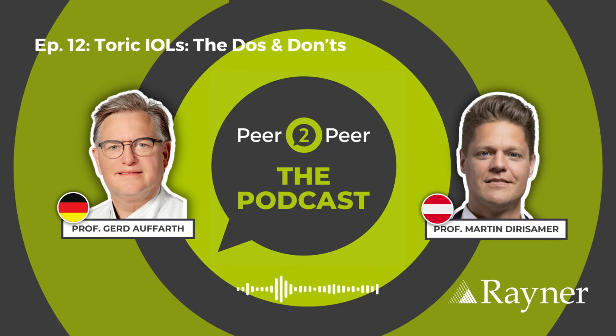And that's a very good question, because if you look to the manufacturer, they have probably quarter diopter steps. So the question is how precise we can be with quarter diopter steps, and even there, this is not always a quarter diopter, because it's just in the range of a quarter diopter, so it could be even more or even less. So customized, of course, would be the best, but has a lot of administration and takes time and so on. So my question: do we have experience also with these quarter and half diopter steps, that it might vary a little bit too much?